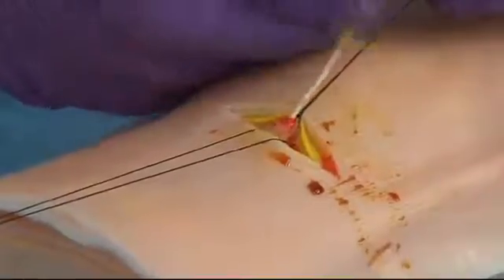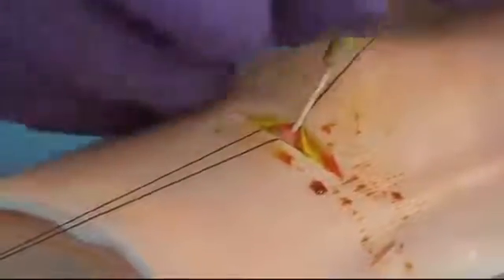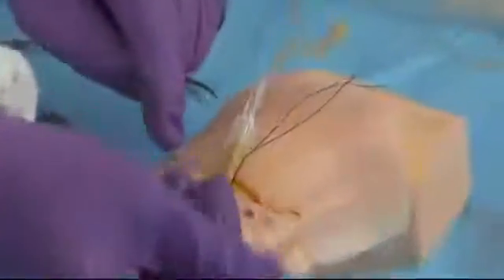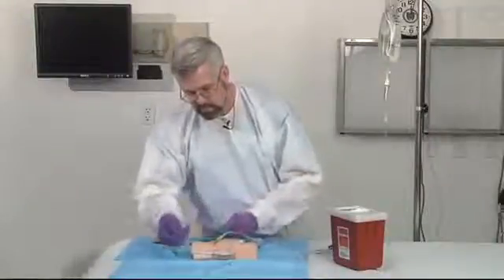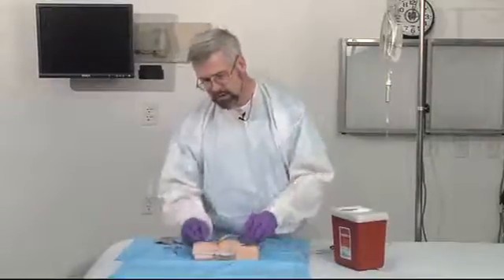Aiming it up towards the head — and now that's in the vessel. I can now place my IV tubing to this and tie this in place. And we now have a functioning line at the ankle that we can deliver high volumes of fluid to.